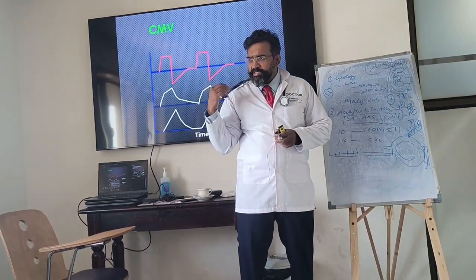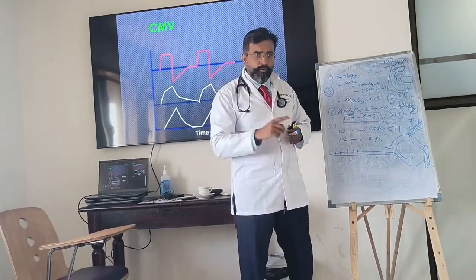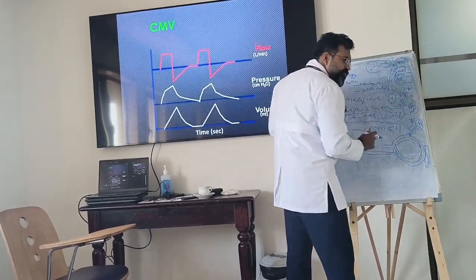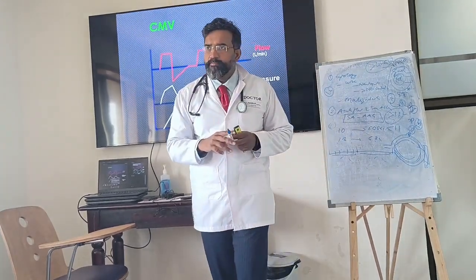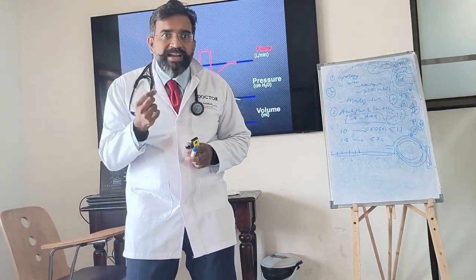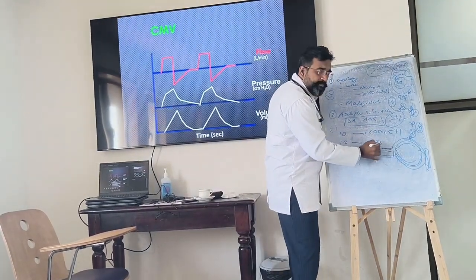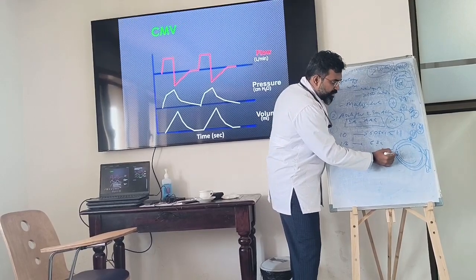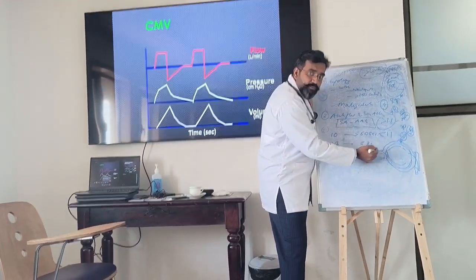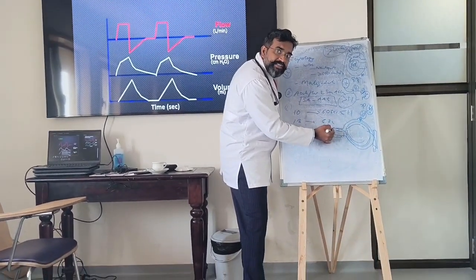circuit is very intelligent. Intelligently, there is a bias flow going on, a flow going inside like a circle, all the time. There's a very tiny flow going on all the time. So when the patient takes a breath, or initiates a breath, the flow will slightly change. A little flow will come this way. Understood? It became positive because the air is going from here.